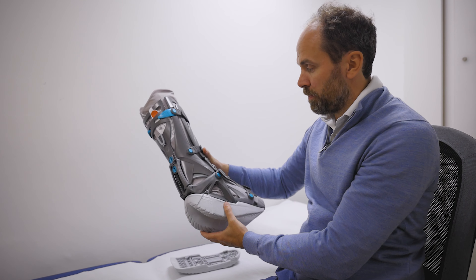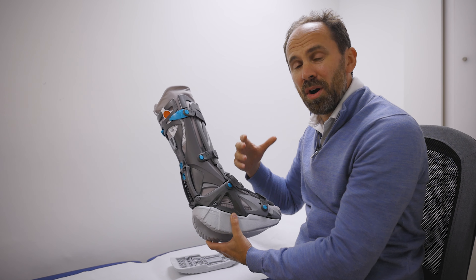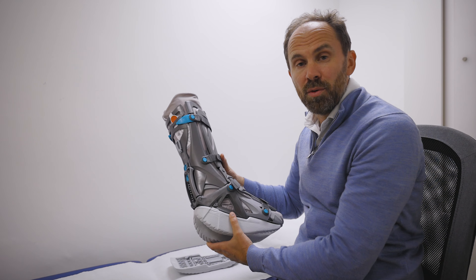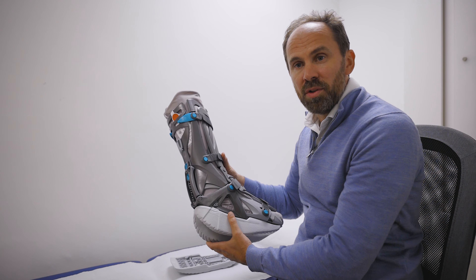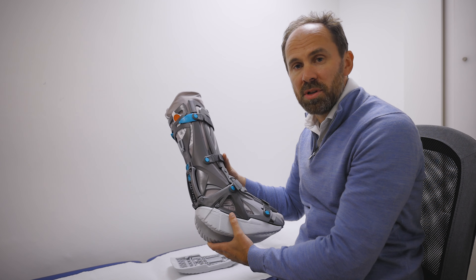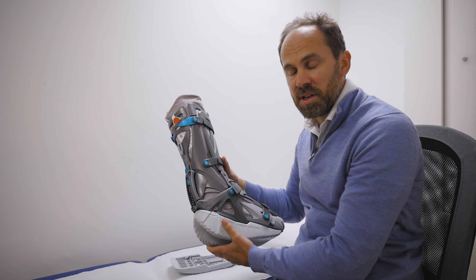The VACO-PED is a very fancy looking boot and we're going to go through what the important things are. Quite often when you get these, you're given an awful lot of information and you need to remember exactly what to do. It's so important that you're in the right position at the right stage for the healing process.